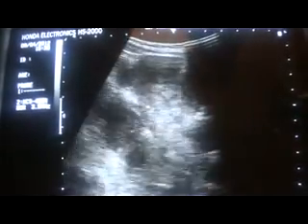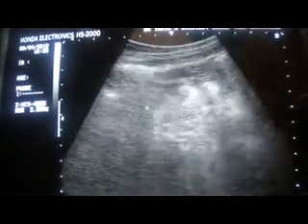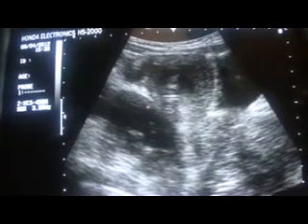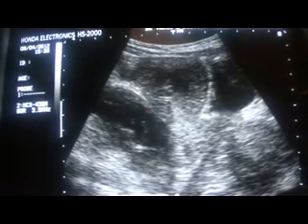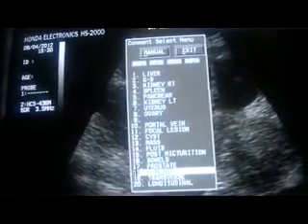This is the cervix of the uterus, quite thick, bulky, and the central hypoechoic area is the cervical canal. Now this is fluid collection posterior to the uterus and is extending towards the right lower quadrant. This is fluid with internal echoes.